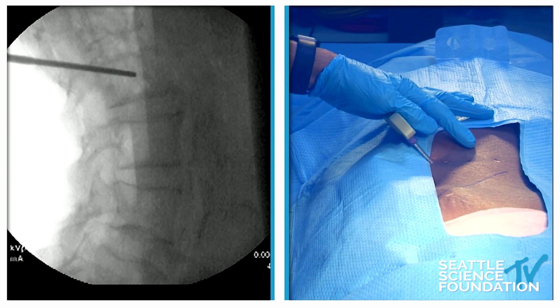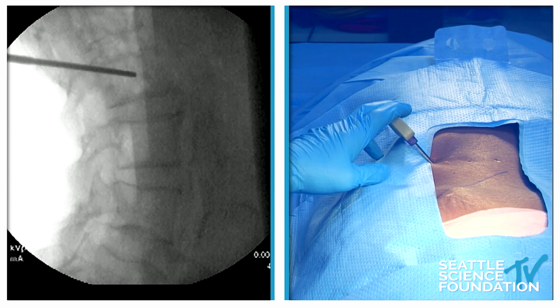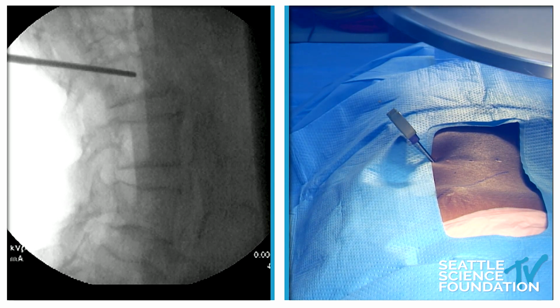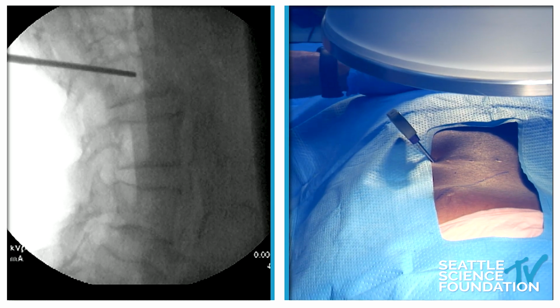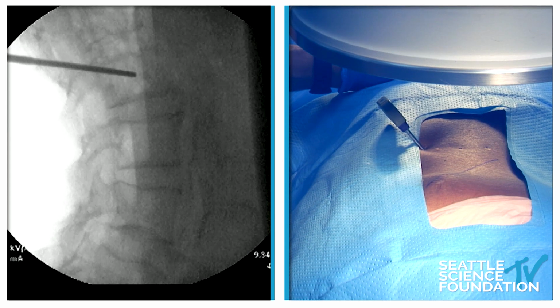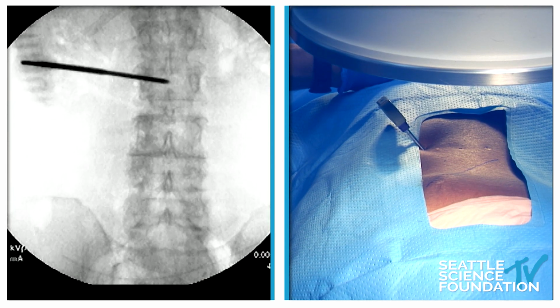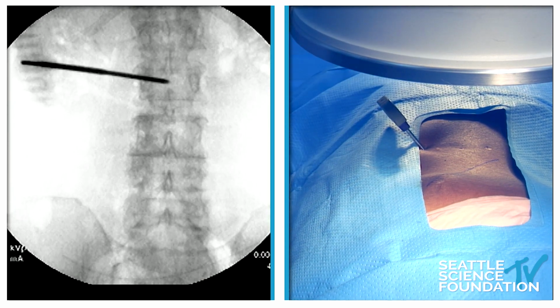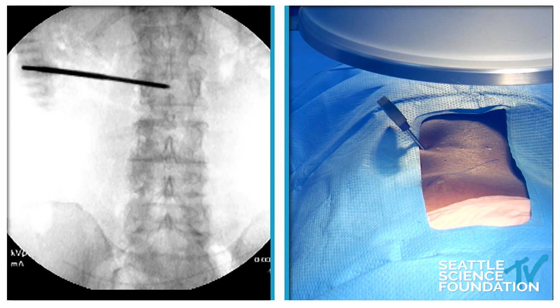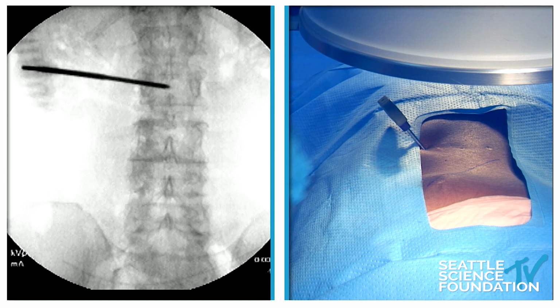All right, background AP, and you can see the trajectory of the needle is no longer 30 degrees, it's more like a 45 degree angle when measured against the walls and the floor. So this is in the middle on the lateral, and in the middle on the AP, and this is a very quick, easy approach. We were able to tag the center of the vertebral body. So this is a way to medialize and get more medial reproducibly.